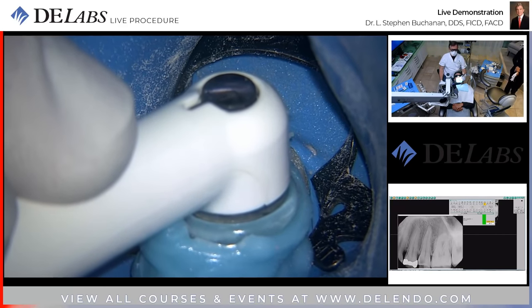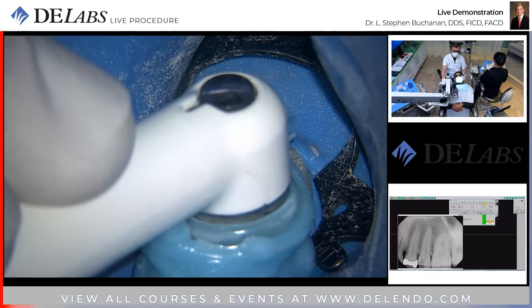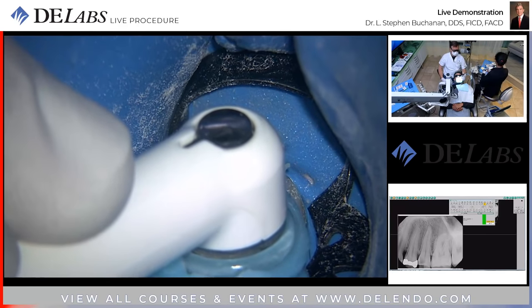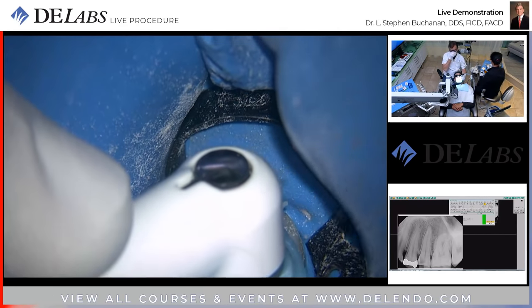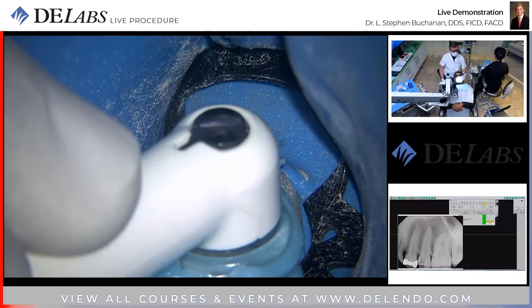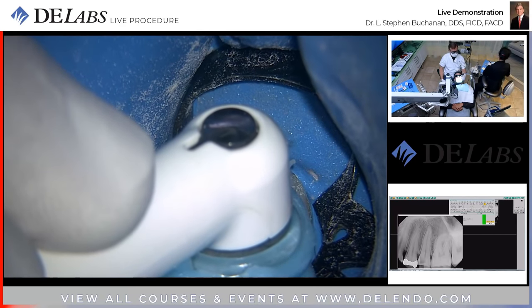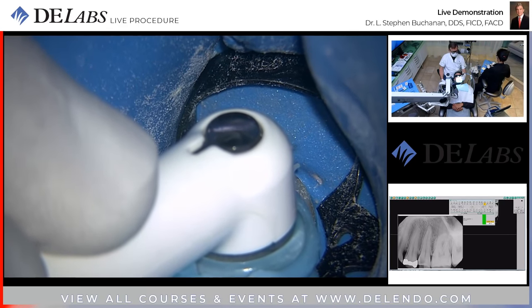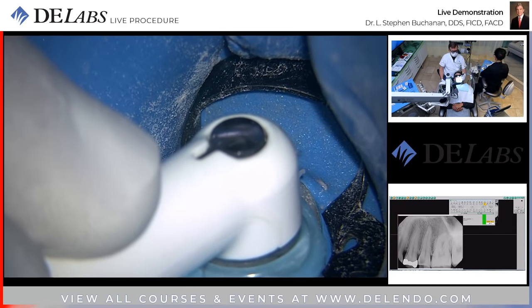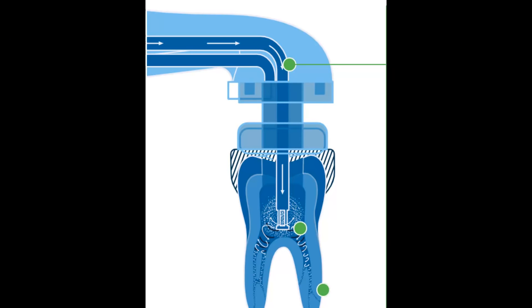I like these new black rubber dam clamps. They are so much less reflective. So she's got that hypertonic saline. We're going to just now finish up the hypochlorite cycle. And that completes 5 minutes of sodium hypochlorite activity.